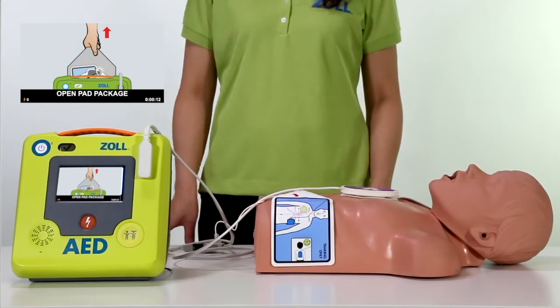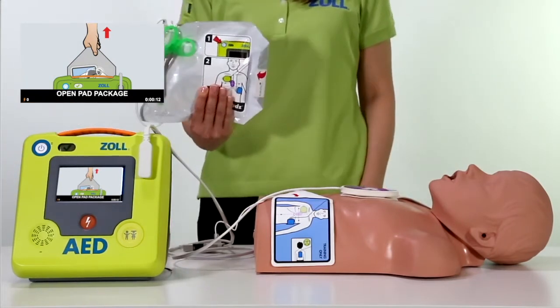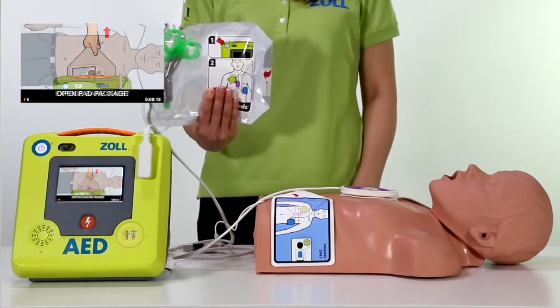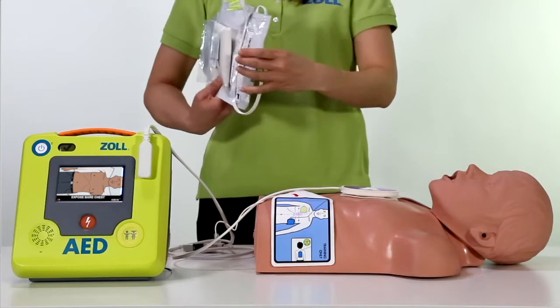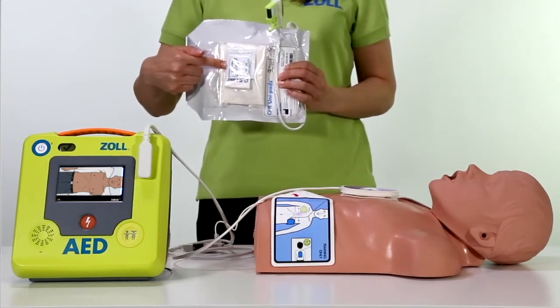Remove the pad package. Cut or tear clothing to expose the patient's bare chest. The pad package includes a large scissor for cutting away clothing. It also includes a patient prep kit with razor, wipes, and other items.